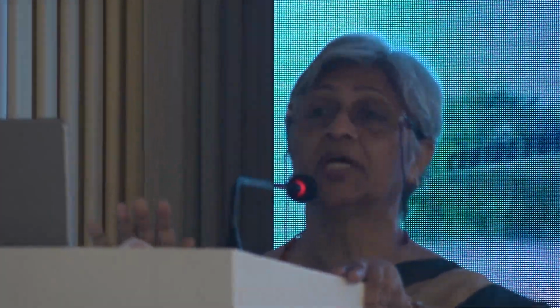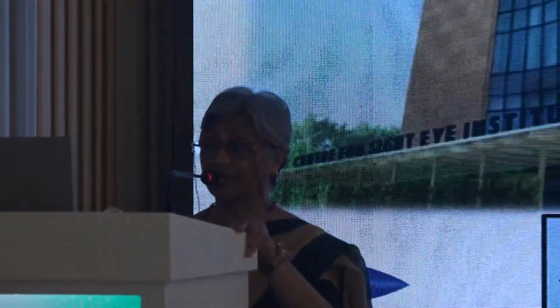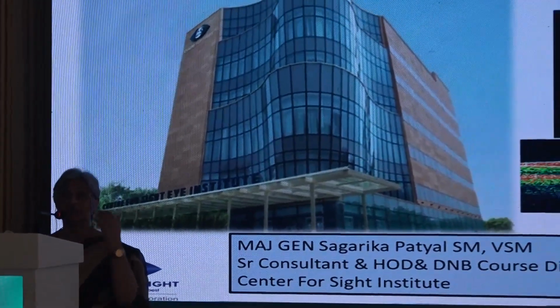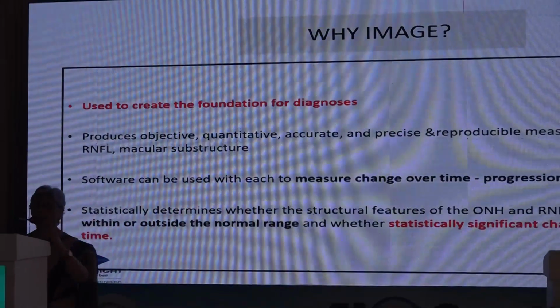How and what are the problems, and how to interpret OCT in order to help our glaucoma diagnosis. And I would invite questions, because when you ask questions, it also helps us to think and give you an answer. So why do we image?